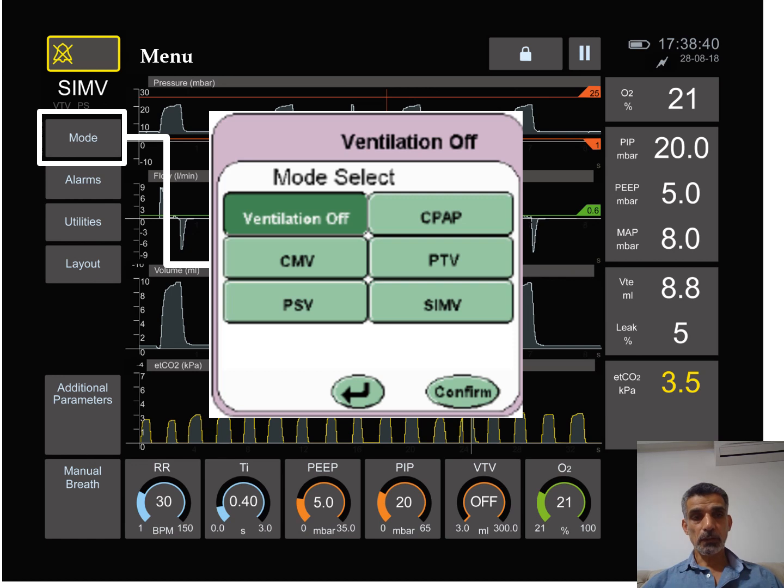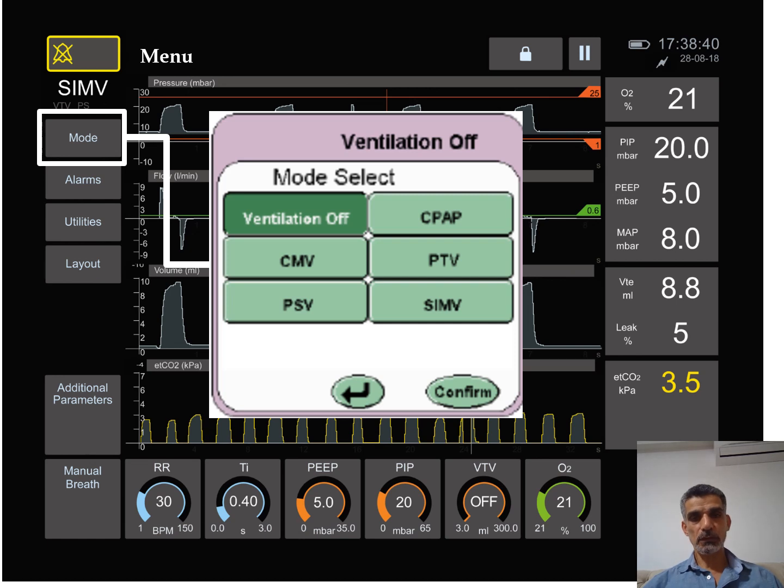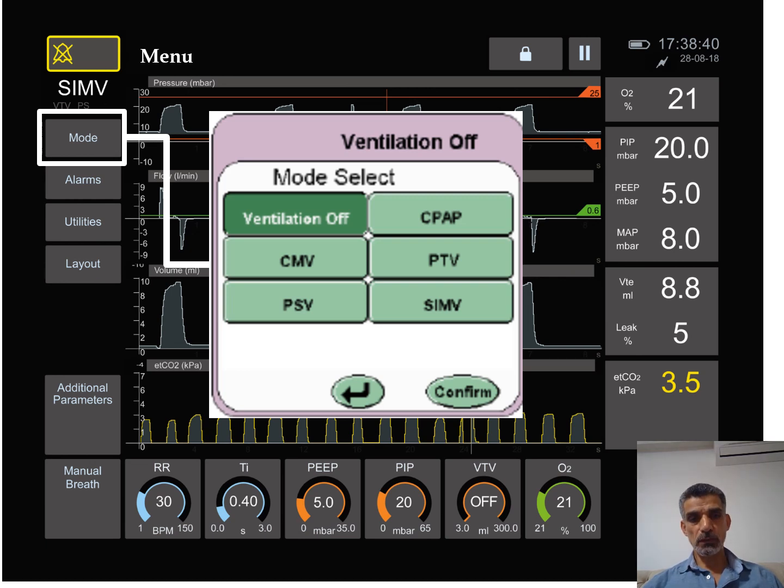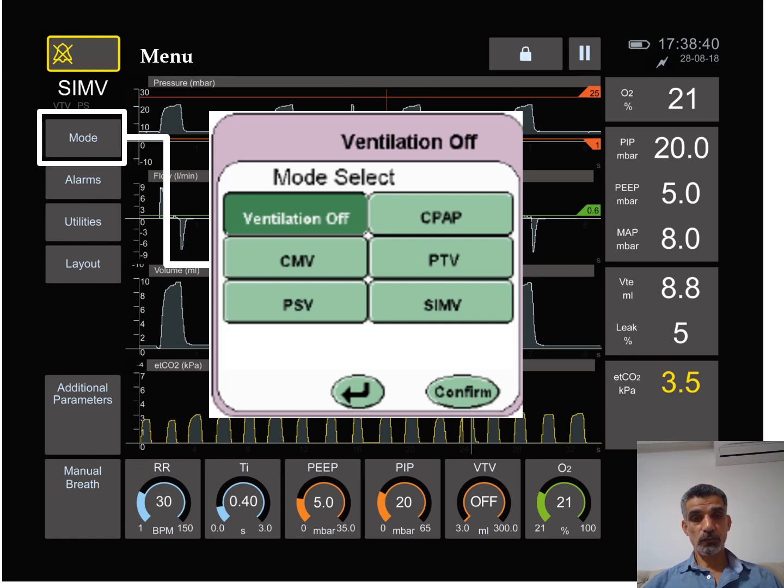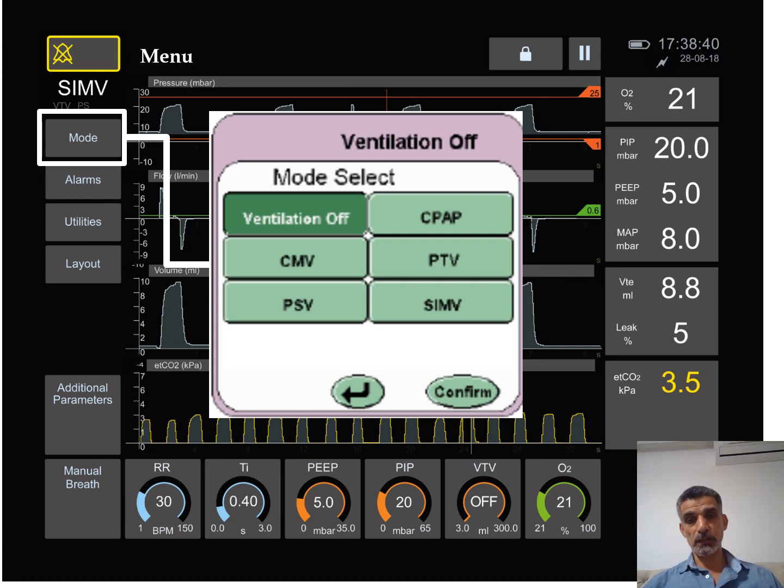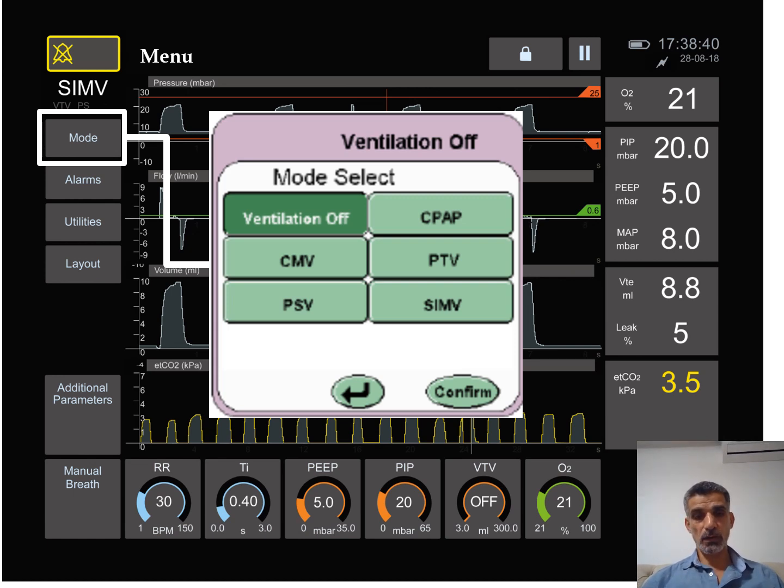Part of the menu is the mode. So if you press here you'll get another screen that tells you what is the mode or the way we ventilate the babies, the characteristics of the set parameters and how the ventilator will behave. So you can have CPAP where you just give PEEP without any pressure and without any cycle. You can give conventional mechanical ventilation, you can give PTV, you can give SIMV, or you can give PC PSV. We'll talk about each with time.